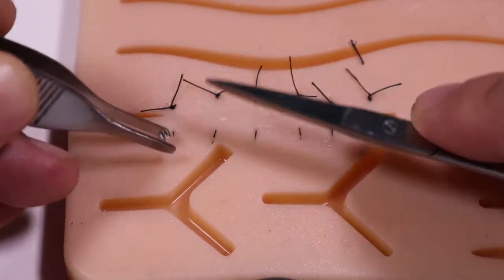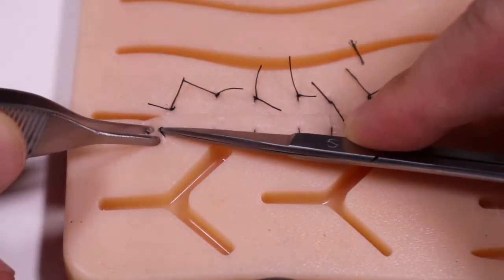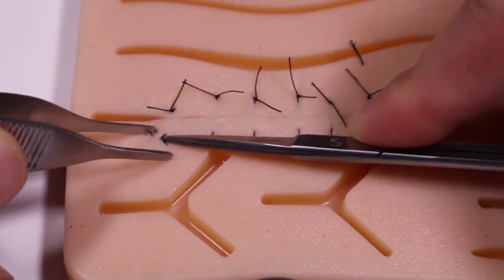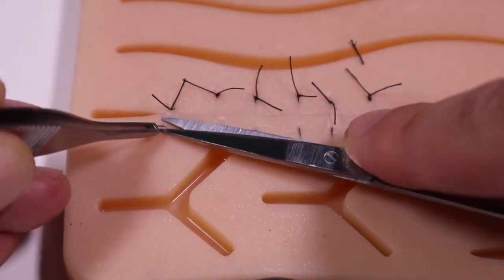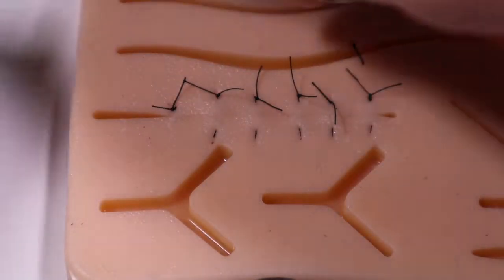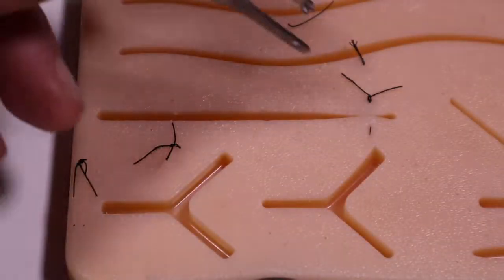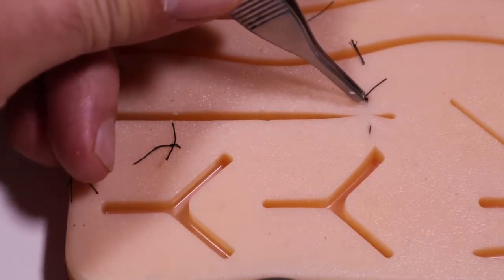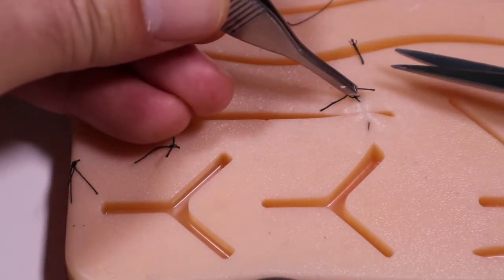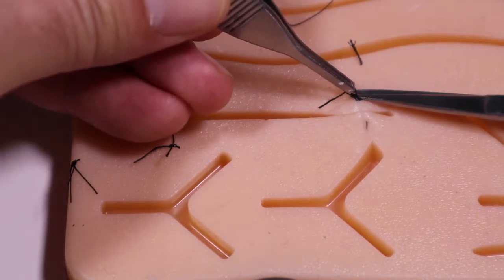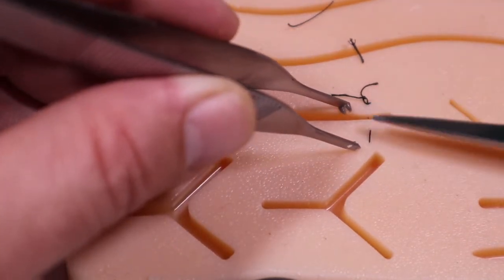So cut our far knot. The suture has kind of cut through the suture board just because I have used it several times. We will pull that through, grab and pull slightly, cut at the skin, and pull the knot.